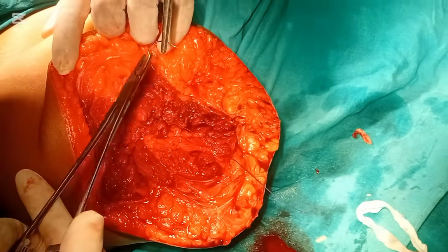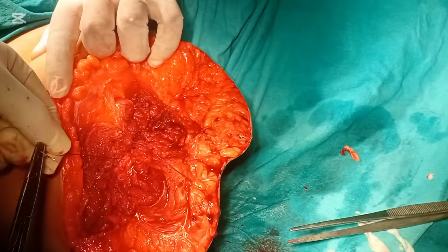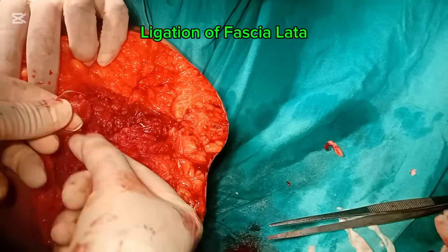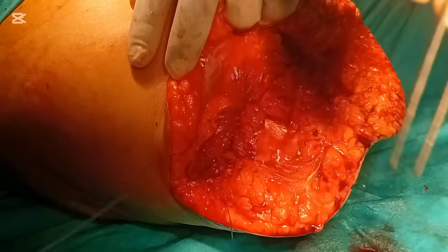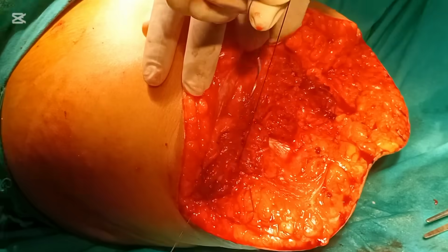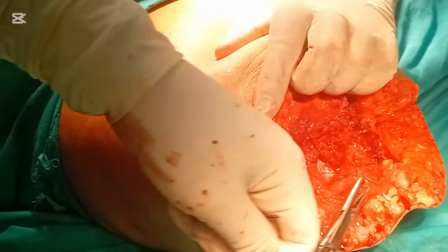The myoplasty is done in two layers to completely obscure the bone. Fascia is being ligated at the end of the procedure to make the compartment closely fit under your skin so that flap coverage is sufficient. Skin is closed only when it is needed, otherwise it is left open in infected cases.